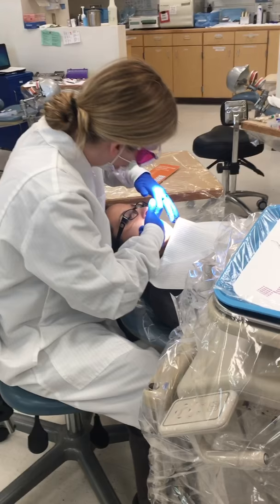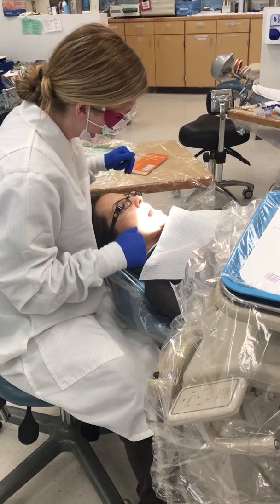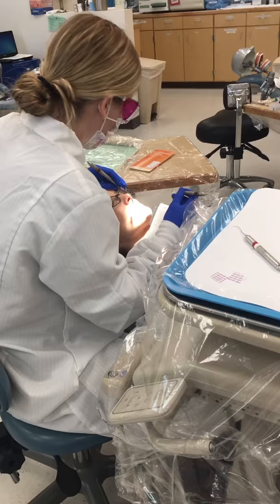You have 28 teeth. Now we're going to go through and do a perio chart. I'm going to take some measurements and call out some numbers.